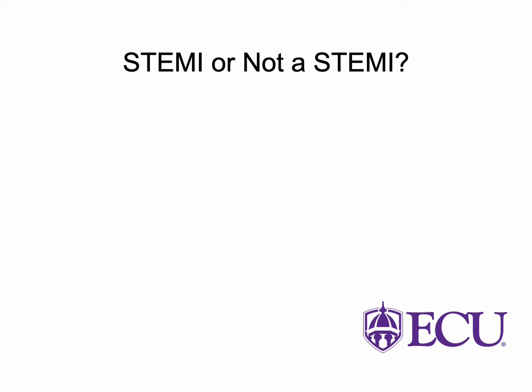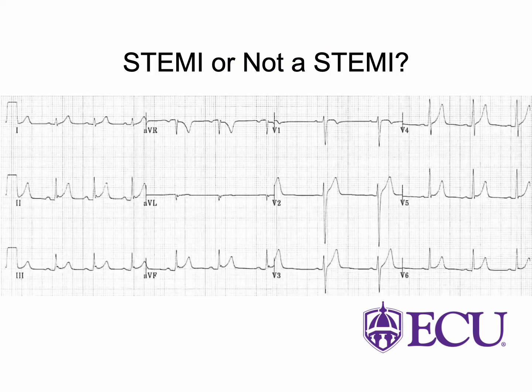STEMI or not a STEMI. So just looking at this, take a second, see what you think. For me, just eyeballing this, right? It looks a little interesting. There's maybe a little bit of elevation here in 2 and V3. I could also convince myself in AVF there's some elevation.